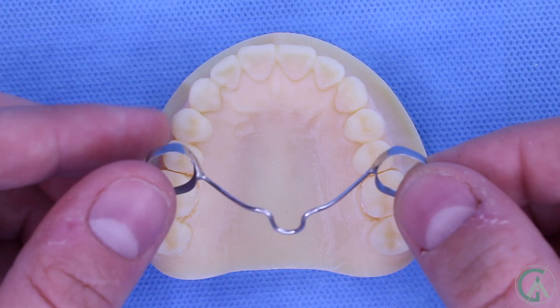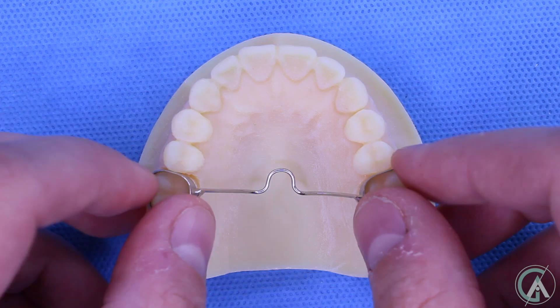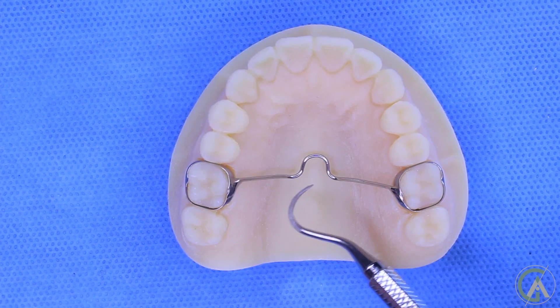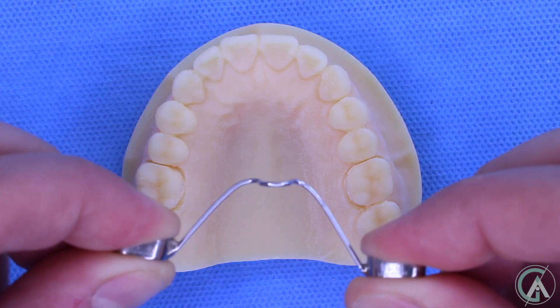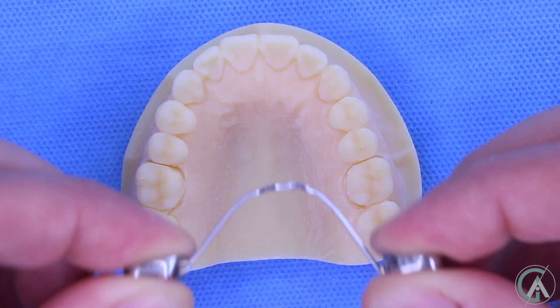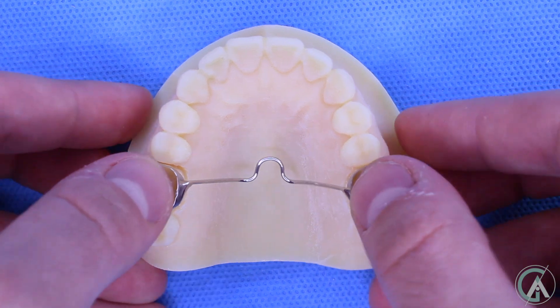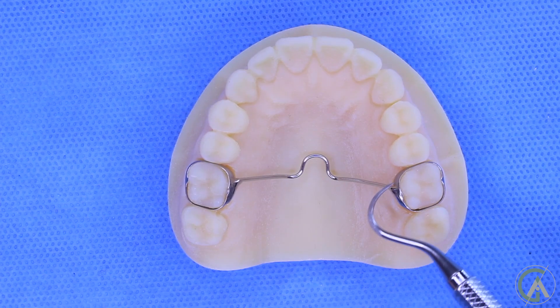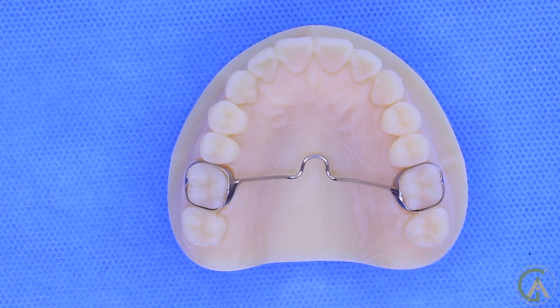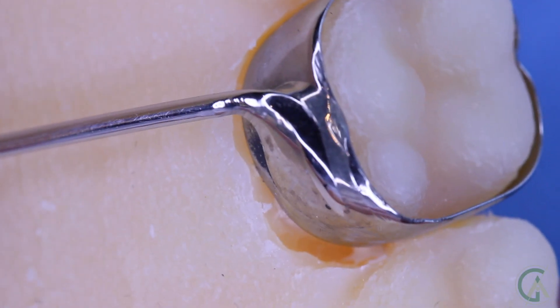A TPA consists of bands that go on your molar teeth with a wire that goes across your palate. You can see here that there is a little U-shaped bend that goes in the palate, and that either points forward or backwards, which allows for modifications that occur in the TPA before we cement it in. The TPA is either soldered onto the molar bands or has little slits to attach it so that it's removable and adjustable.